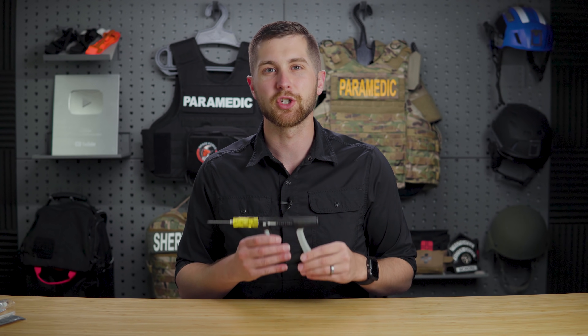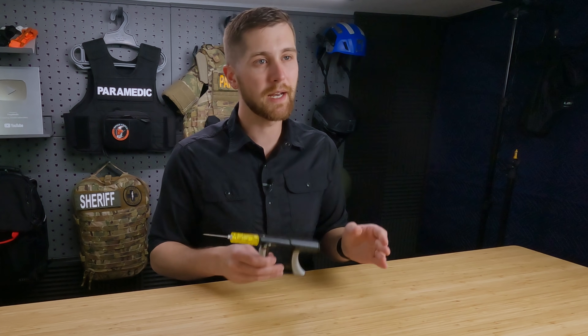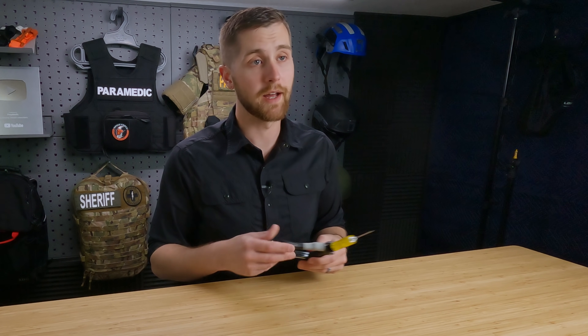The advantages of this procedure are that it takes about 20 seconds start to finish to get one in, and it has about double the success rate of an IV. Downsides are it's a scary-looking procedure and it can be very painful for the patient. In extreme emergent situations this is a great tool and carries not too many more harmful effects than an IV.